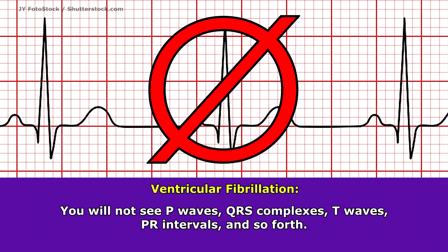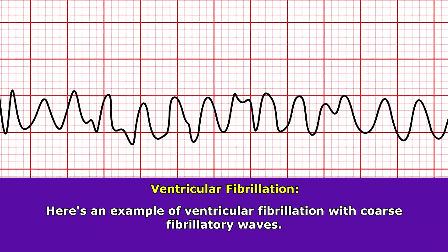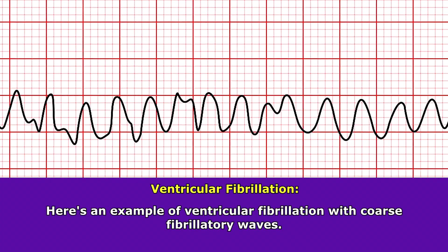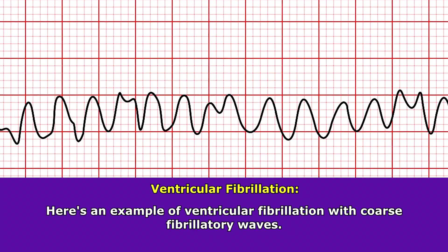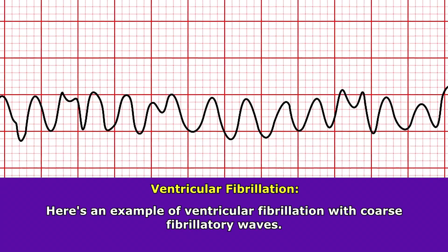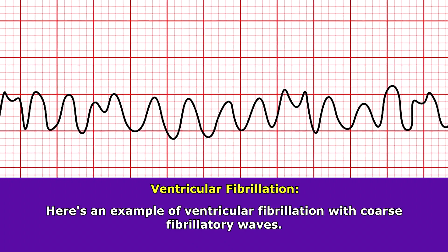Due to the nature of this rhythm, you're not going to be able to see P waves, QRS complexes, T waves, PR intervals, or anything like that. And here on this strip, you can see a classic example of ventricular fibrillation.